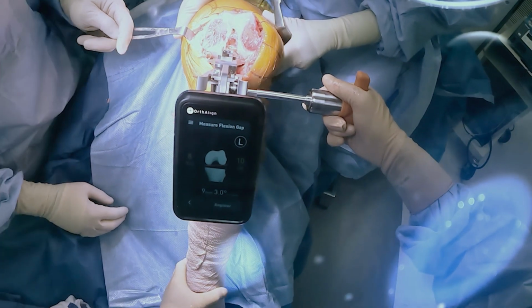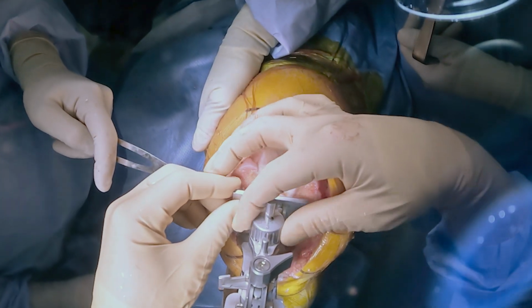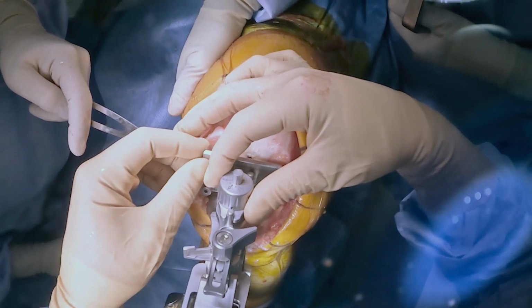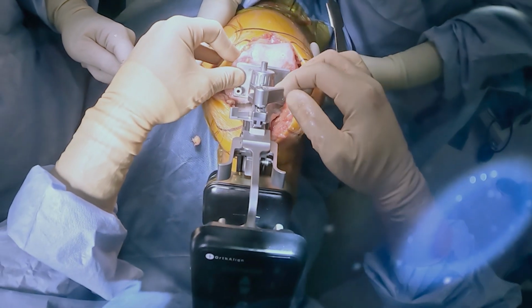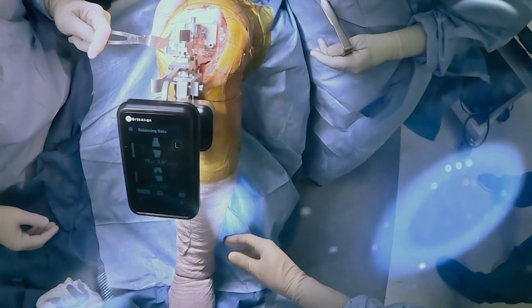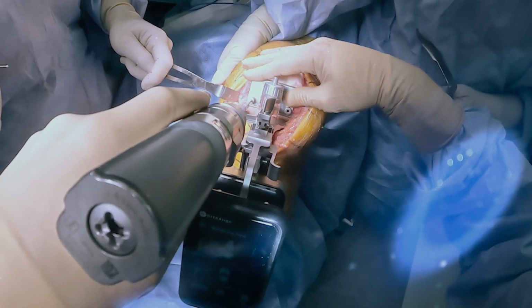Here we are setting our flexion gap. We just created a rectangular space which is parallel to the tibial cut. And once we have determined the appropriate depth of resection, we're using pins into an implant-specific drill plate, which is unique to each manufacturer. This gives us the luxury of being able to use any implant with this system because it's an open platform, and it allows you to not be bound either in an ASC or a hospital setting.